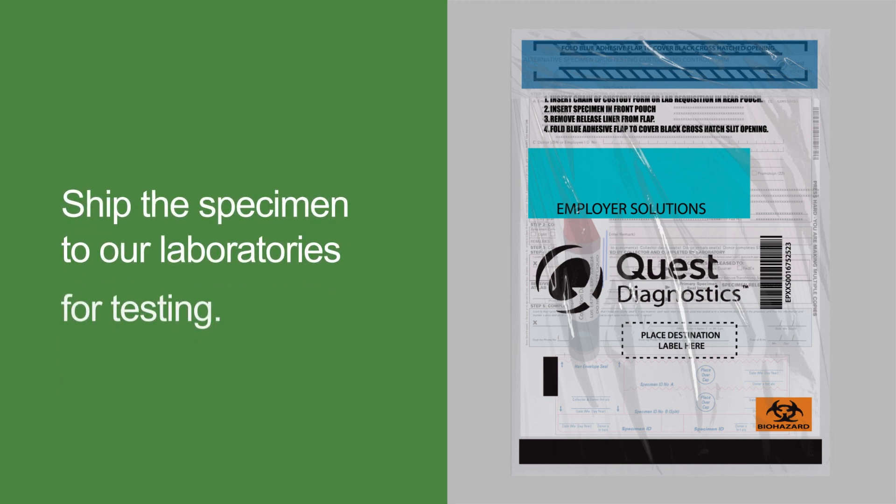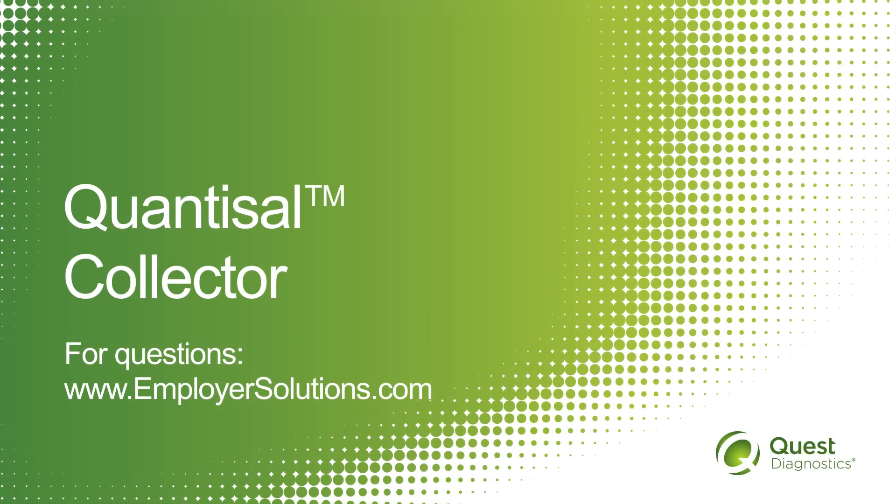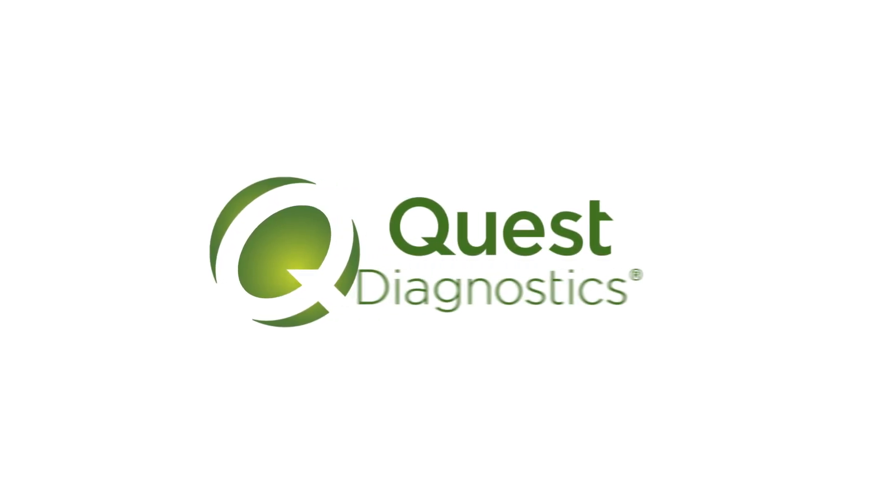Place the tube and form in the specimen bag and ready for shipping. If you are interested in getting started with Quantisal, contact your account manager or connect with us online at EmployerSolutions.com. Thank you!